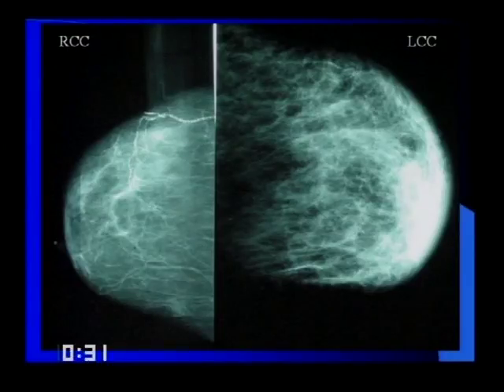So in such a case, when there is a diffuse increase in one side, I'm considering more some diffuse process, such as an inflammatory carcinoma, if she has more signs of infection. There could be mastitis. If she has had some kind of surgery on the left axilla for anything else, not for breast CA, there could be some lymphatic obstruction there. It's not bilateral, so I'm not thinking in terms of CHF. So that's about it. Okay.